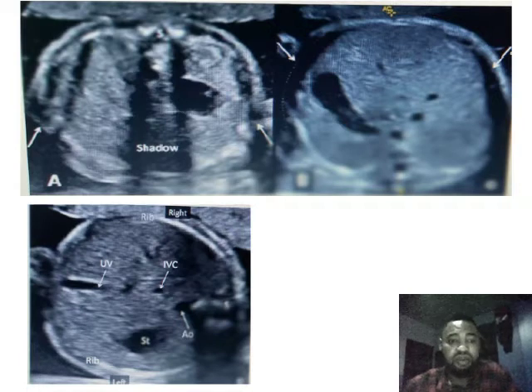But the last one here is the correct abdominal circumference, showing the IVC, showing the stomach bubbles, showing the umbilical vein, and the AO. So if we measure this one, we are going to get the accurate gestational age.